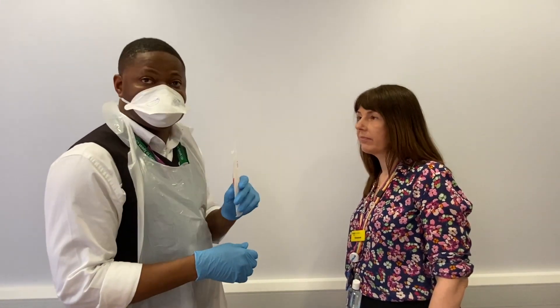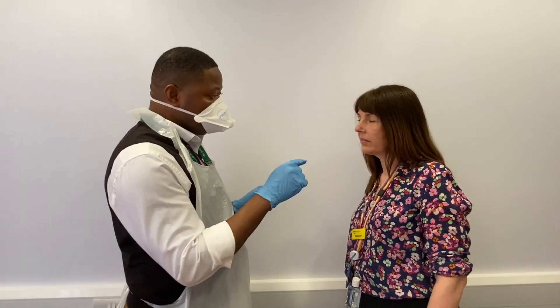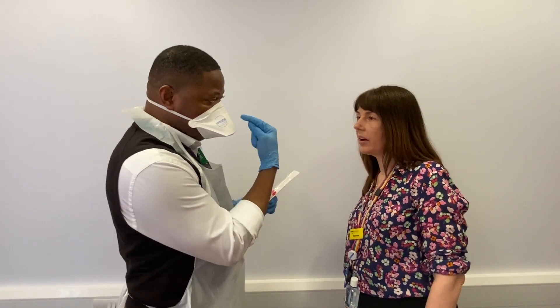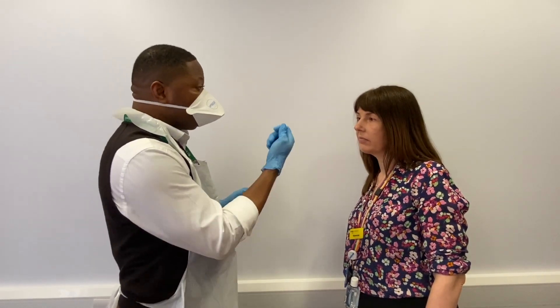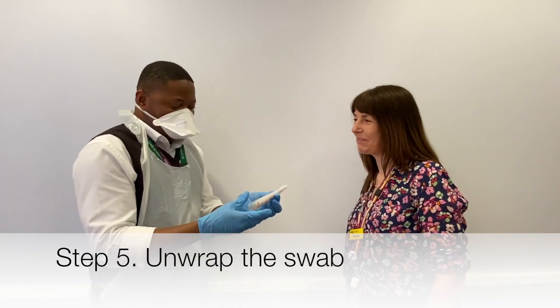I'm going to explain to Vanessa what the procedure is. Vanessa, I'm about to do a swab on you for the COVID-19 virus. Just to let you know it will be slightly intrusive — going to the back of your throat and also into your nose — and it may be a little ticklish as well. Is that okay? Yeah. Okay.